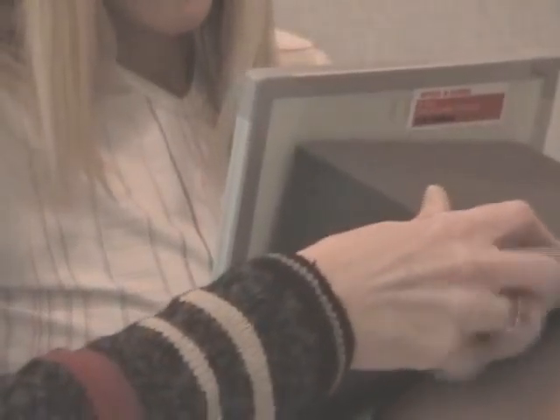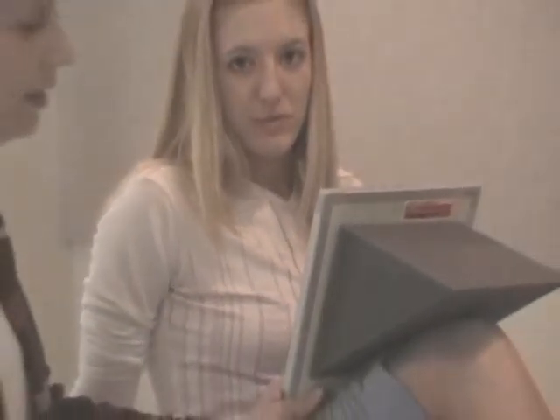If the patient's having difficulty holding this exam, and holding the cassette, and they will, and the cassette moves on you, you might end up with motion. So using a sponge like this can be very beneficial for stability reasons. Again, I have more than 40 inches SID compensating for that OID.